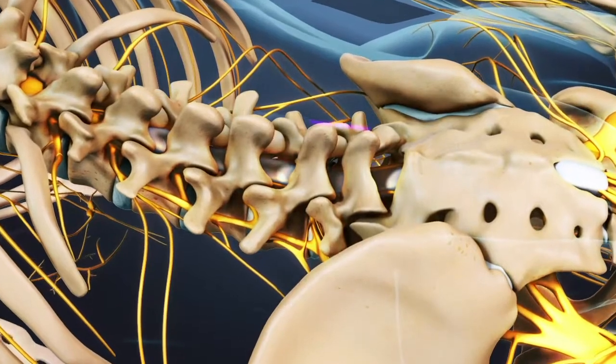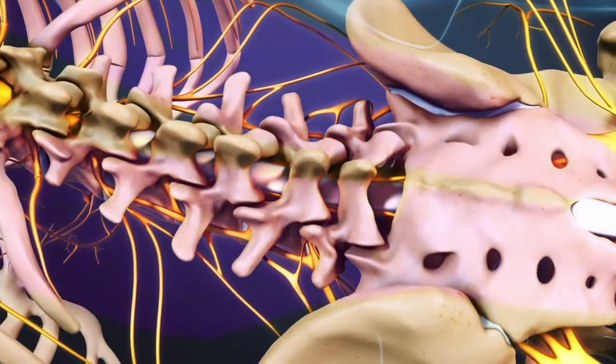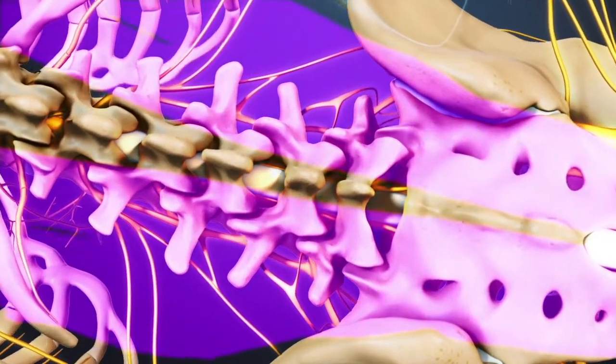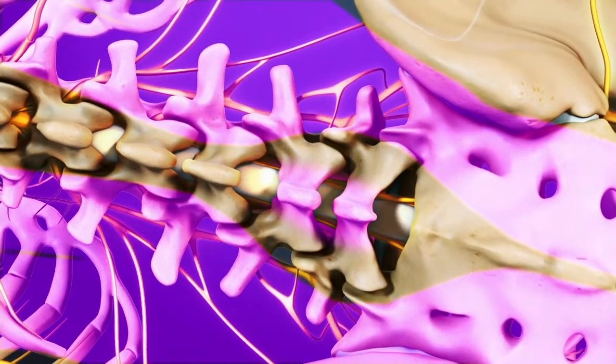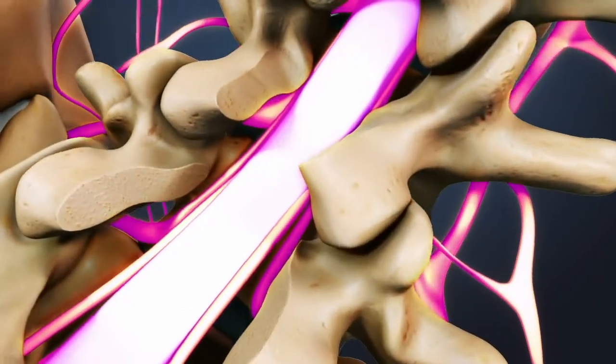A PLIF starts with a three to six inch long incision in the midline of the back. Next, the lower back muscles, called erector spinae, are stripped off of the lamina on both sides and at multiple levels. The lamina is then removed, which allows visualization of the nerve roots.